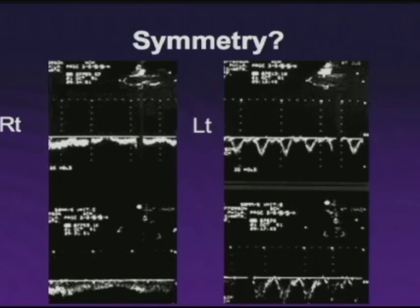However, when we compare the right side we just saw with its corresponding left side, we can immediately appreciate the asymmetry, the normal extreme pulsatility that should be present, and therefore it's no problem to diagnose the right side as blunted, indicating obstruction at the right innominate level.